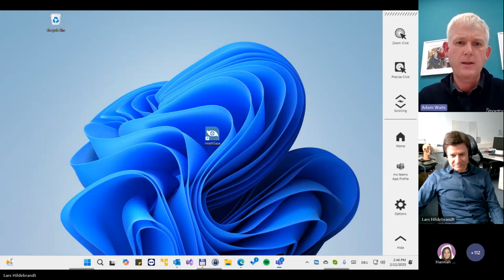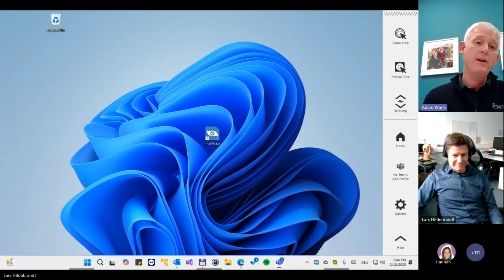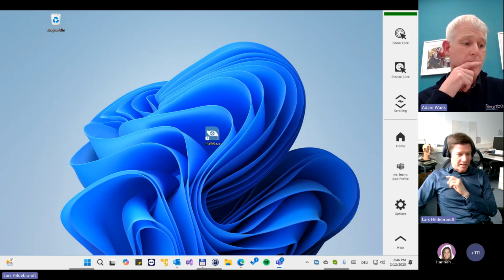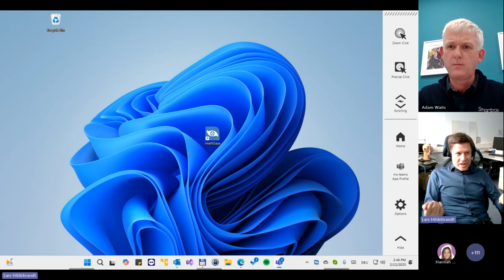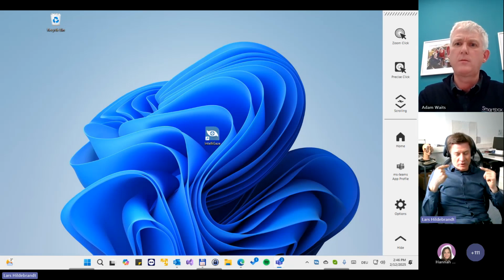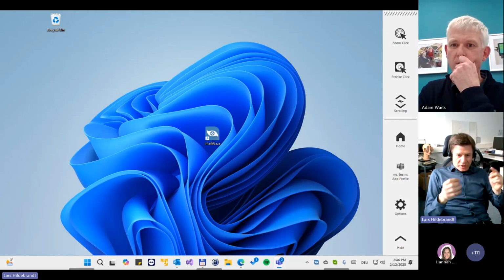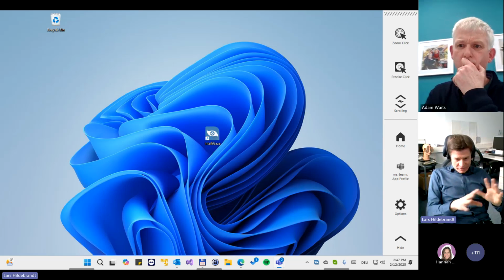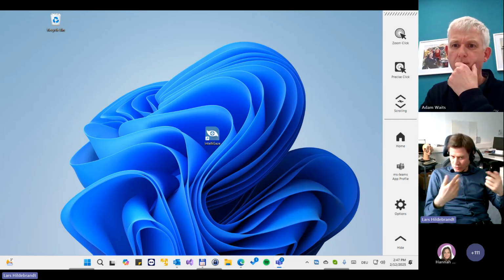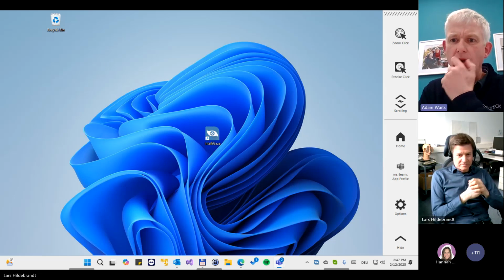Yeah, great, thanks, Lars. So question about Android phone. If you're mirroring an Android phone, can you make a call with that Android phone? Yes, we tried this already. I mean, you already hear the output of the Android phone over the speaker of your grid pad or computer. But the other way around, it's not working. But what you can do is you can put the Android phone to the speaker of your phone, close to it, and then use your voice generation tool, let it be Grid, to speak to the other person. So you can do real phone calls with that.